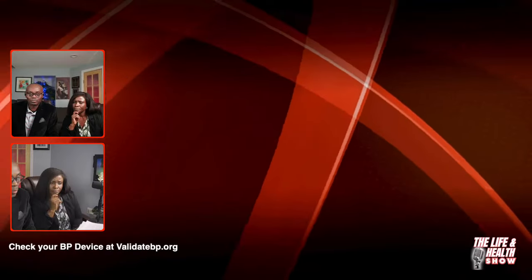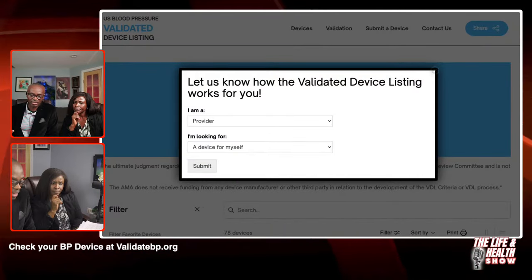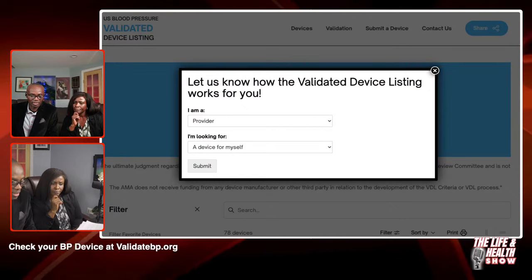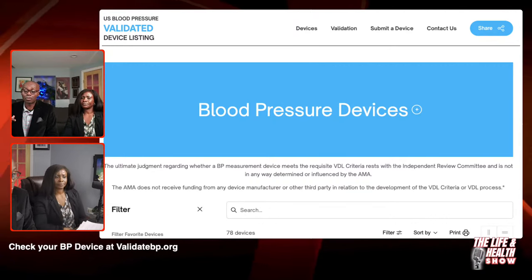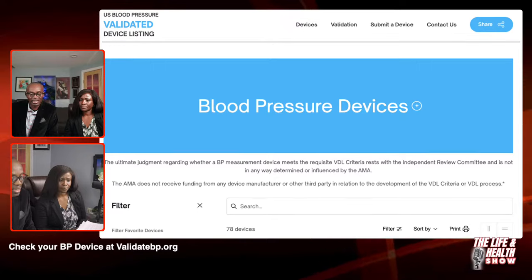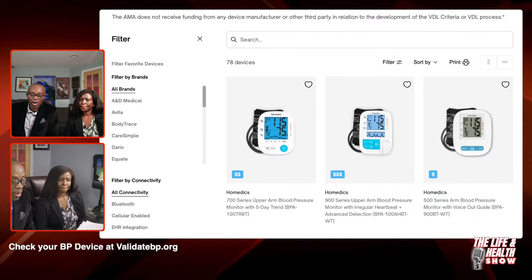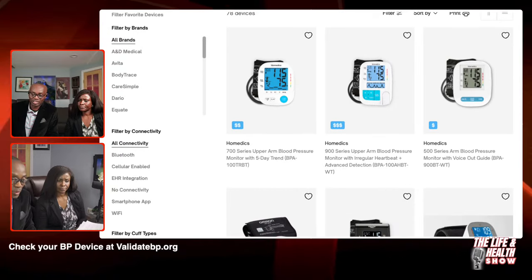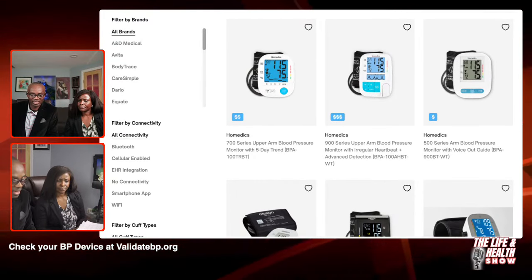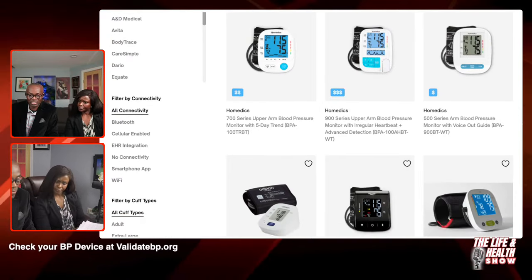So let's see. I'm going to show you some of the things that I think they show on there. Their website, which I've put down there, is validatebp.org, which is the website that they have. If you punch in your blood pressure device type, then it will be able to tell you which ones are good, which ones are not good. And they have several types of machines that have been validated on that site. So you could just go in there. Again, the website is right there, validatebp.org. And you could use that as a tool to see if your machine is approved.